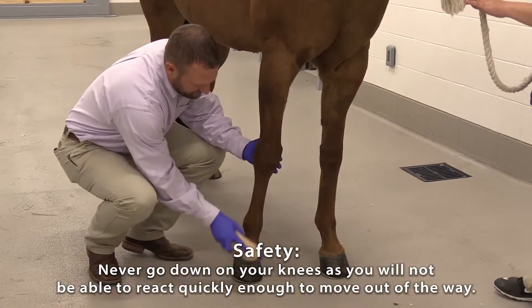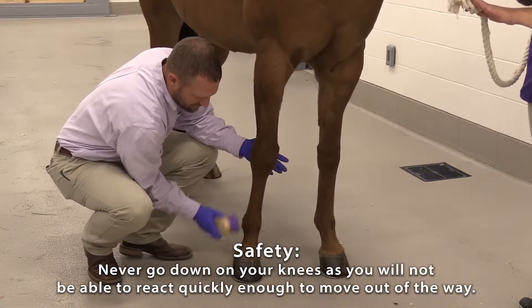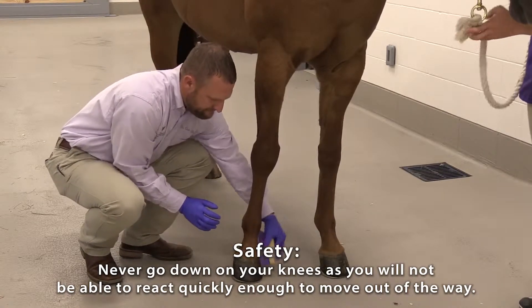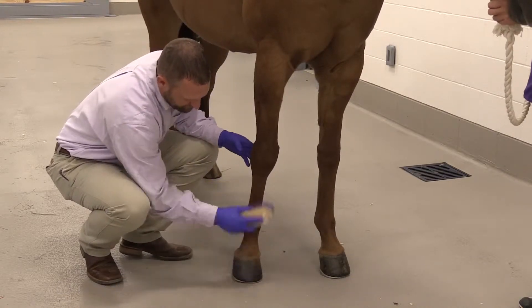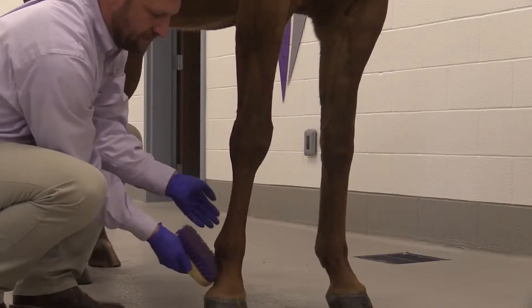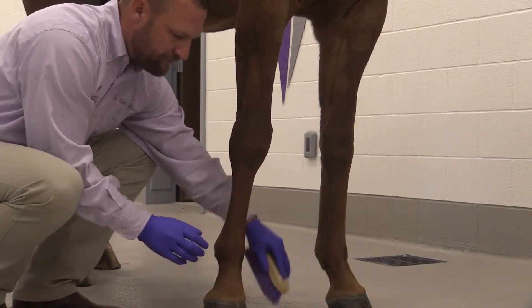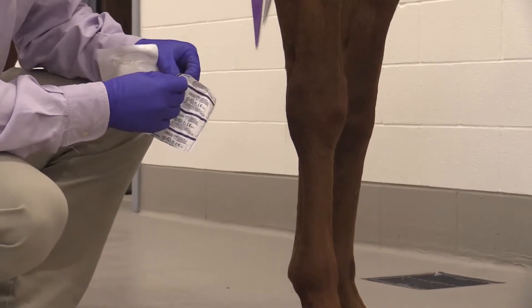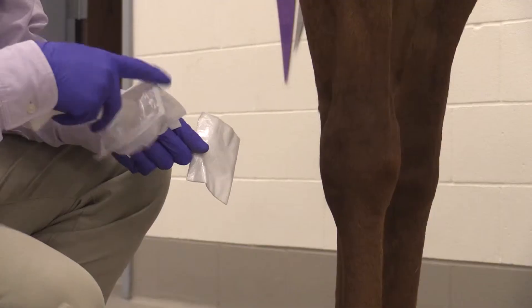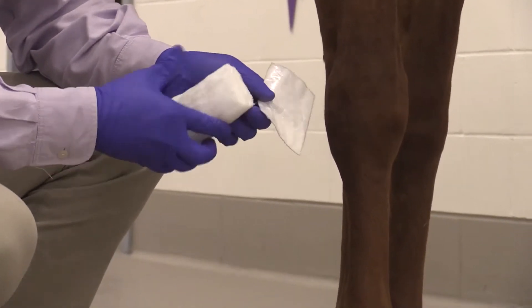Initially, we will start by making sure the leg is clean. Any dirt or debris needs to be off the leg prior to putting bandage material on, as a bandage placed over the top could potentially cause bandage sores. You can see that we wear gloves — if there is a wound, to keep bacteria off of that wound. We're just doing a demonstration; there is no wound on this horse's leg. So we're showing that non-adhesive wrap that will go on the leg, held again with this crinkle gauze.